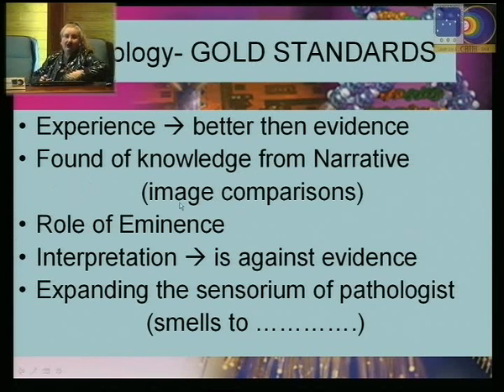And this is the reason why we are pushing so much the project of training pathology quickly with image comparison, in order to have as many pathologists as possible trained on a new tool such as this one. Obviously, there is an eminence role. In pathology, everyone knows that they say this is this because I say that this is this, full stop, no question about it, because I'm an eminence in the area of pathology we are talking about.